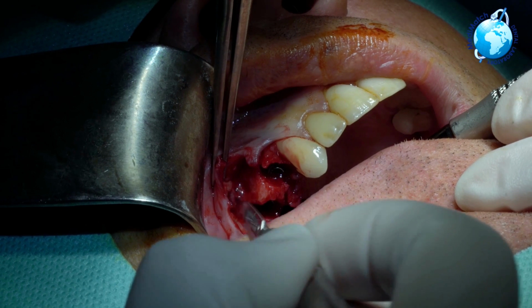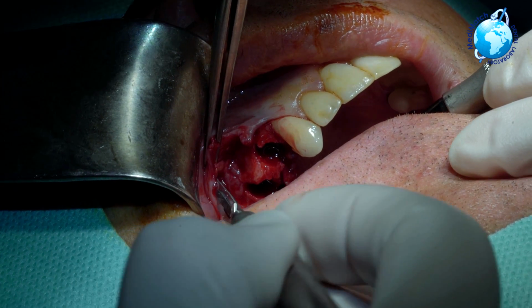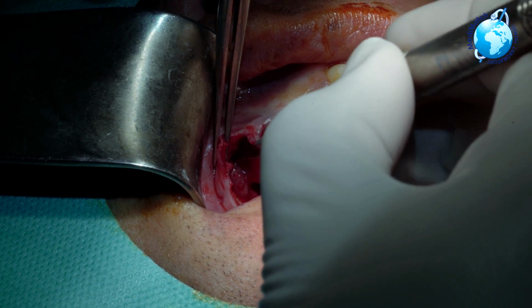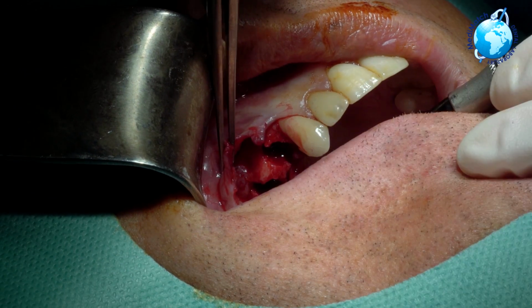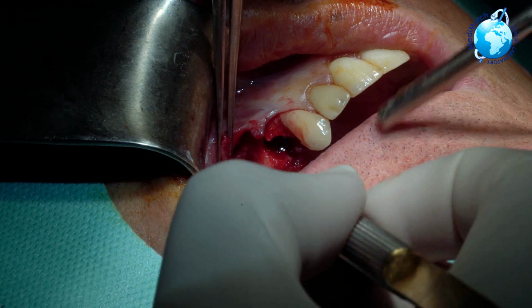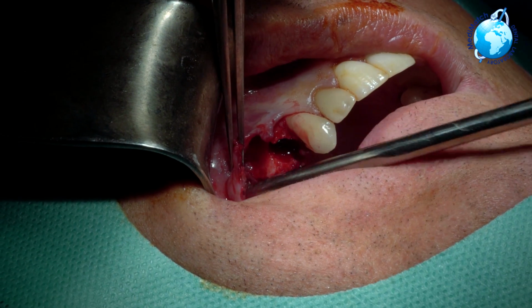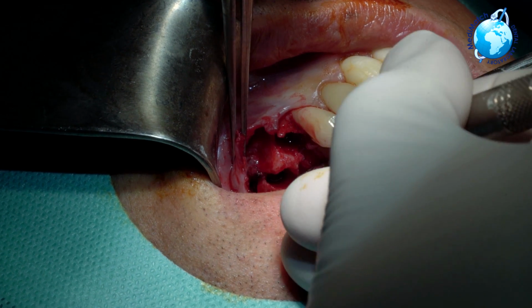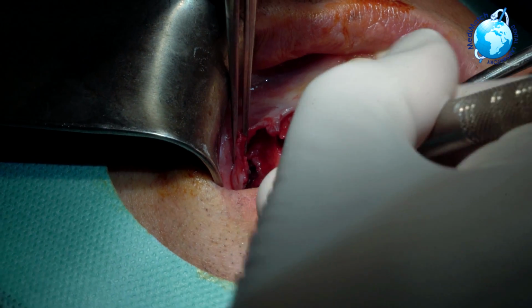And then you can see that granulation tissue emanating from that socket, and we are going to do some enucleation of the cyst using some various periosteal elevators to see the extent of the damage of that infection.